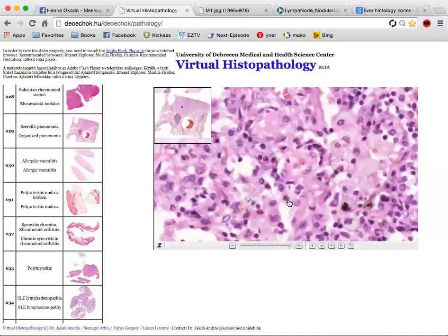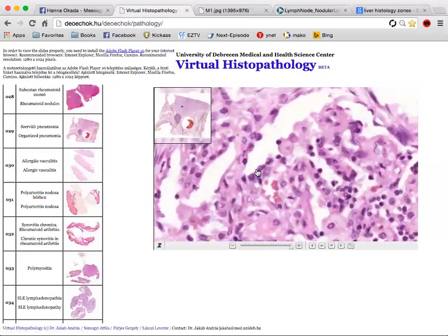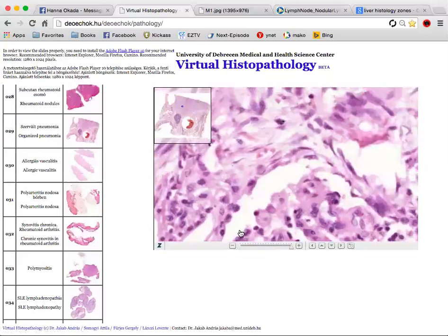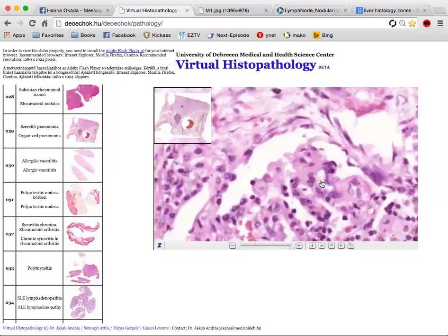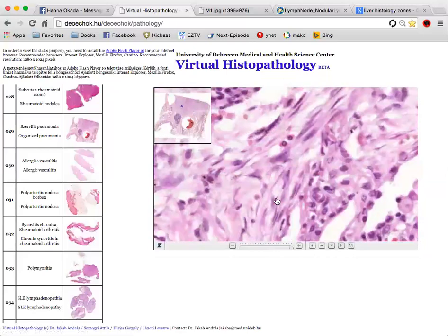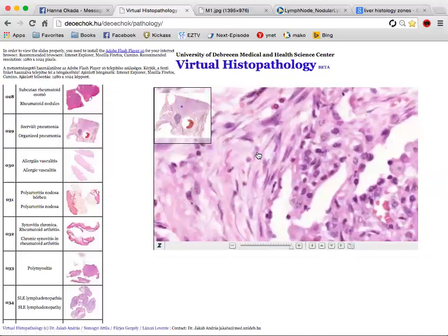It's called bronchial metaplasia. Because of all of these processes going on with the fluids and the granulation tissue and inflammatory cells flowing in there, they become cuboidal, and that also interferes with the gas exchange if there was air in here, which there mostly isn't. It's mostly this fibrous granulation tissue.